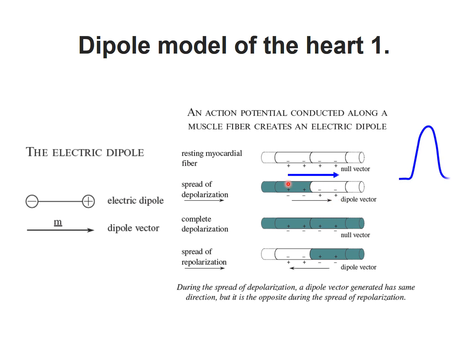When this depolarization spreads along, as you see here, the depolarization vector points toward the undepolarized area. If you place an electrode at this point, when the cells are not depolarized yet, we are going to record a positive deflection, a positive potential difference. As long as the cells are not fully depolarized, we detect positivity, and when they are depolarized, we basically have an isoelectric line.